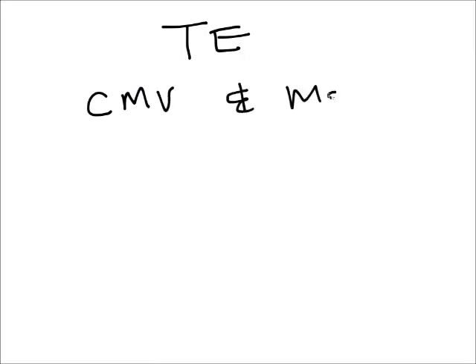I'm going to be talking about expiratory time. So expiratory time, or time expiratory. I'm going to put the symbol TE. And specifically, I'm going to talk about expiratory time in regards to mandatory ventilation, so continuous mandatory ventilation and mandatory breaths.